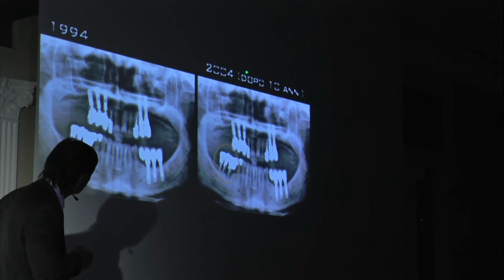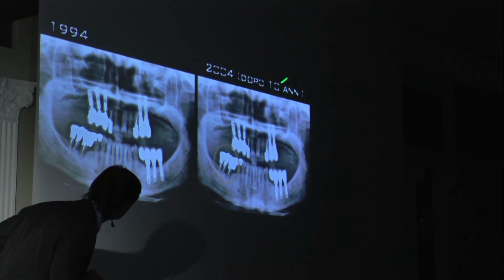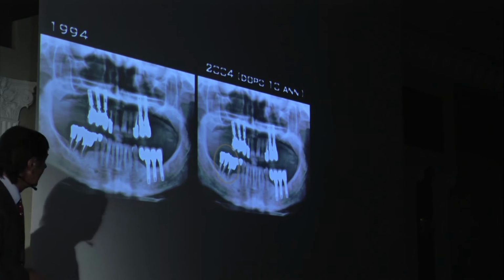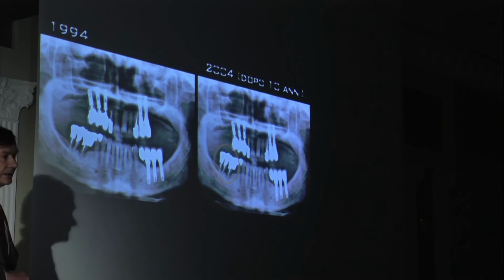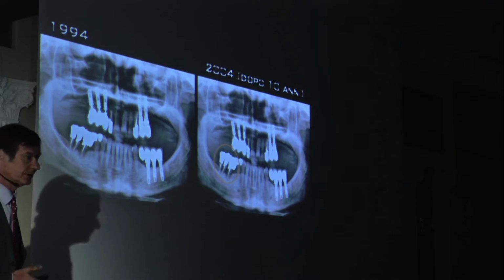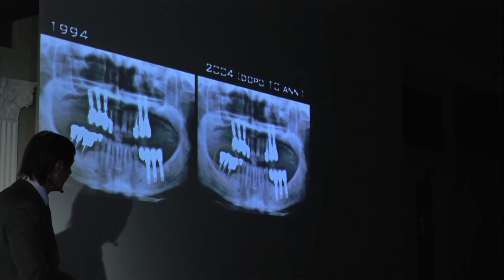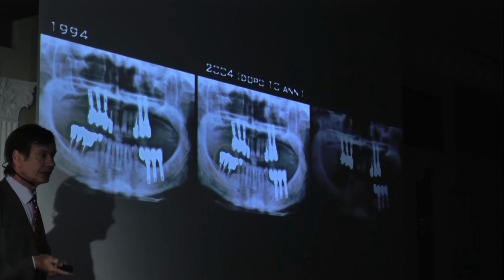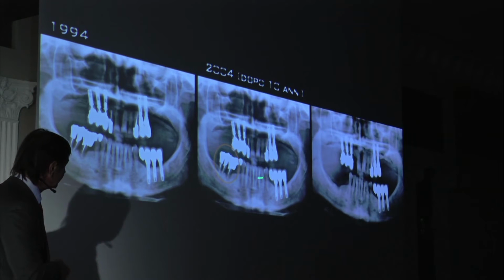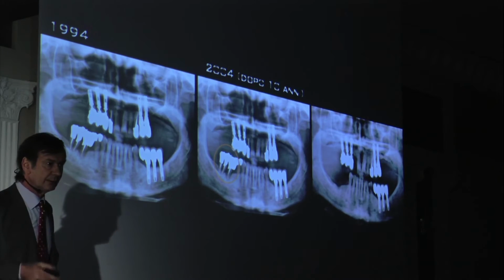After, this is 2004, after 10 years, these teeth finished their life. There was no way to continue to maintain. But the resorption of the bone was so much that there was almost no defect. And you see how stable after 10 years are all the implants in the regenerated bone. Then I just removed the teeth. I waited for 2-3 months to make just regular implants.